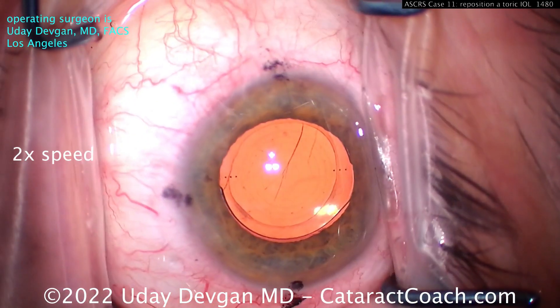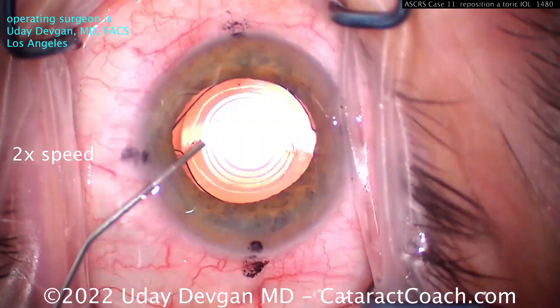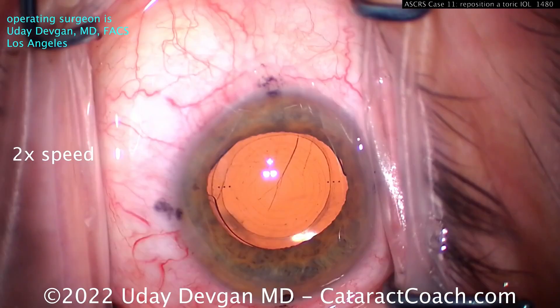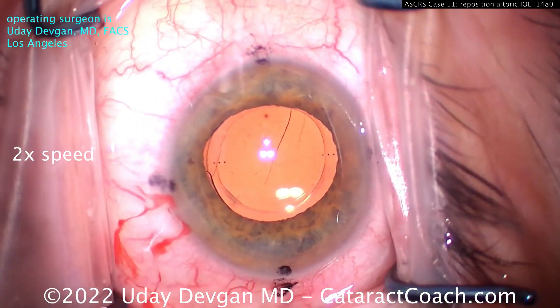The first thing is we only make two paracentesis incisions — no need for a main incision here. We'll fill the eye with viscoelastic. We don't want too big of a fill; you want a normal pressure viscoelastic in the eye, maybe a 60–70% fill.